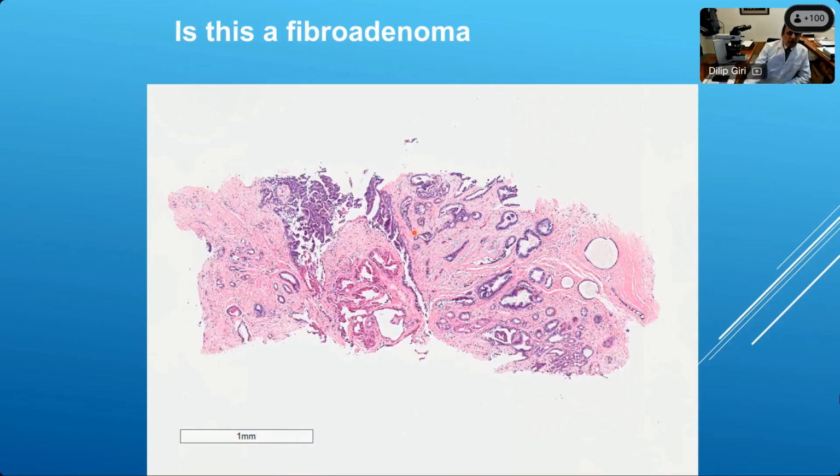So now you have here a small fragment of tissue with some stromal elements, not a picture that I see typically in a fibroadenoma. And then on top of that, there is something like a papilloma growing here. So what am I going to do with it? I will end up with my usual approach, giving a differential diagnosis, and then the excision follows.